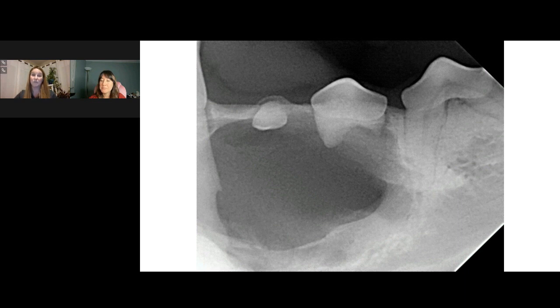Wrong, wrong, wrong. That's the part that's wrong, right? The part where we want to cut corners, that's the part where I'm going to say it's wrong. So we don't want to cut corners. Find what works for you in practice. If the only way your team knows how to take rads is not the position that you know how to extract teeth, maybe we try to find a different way for you to figure out how your team can take rads so that it's practical peri-operatively too.